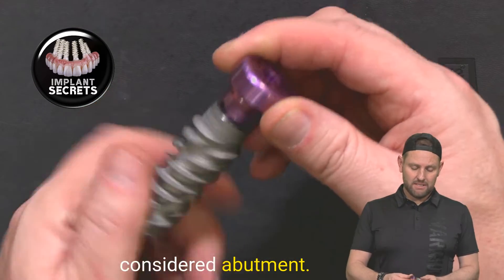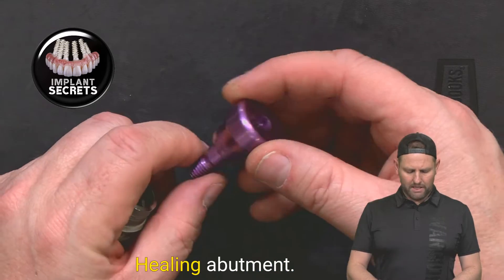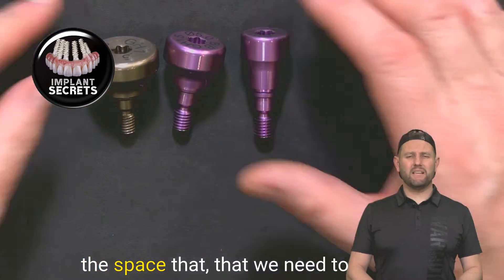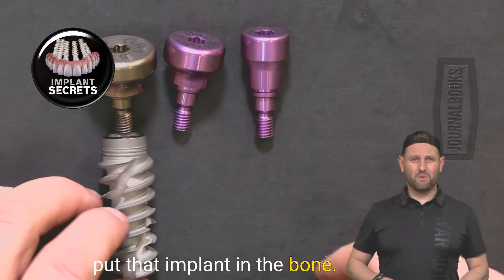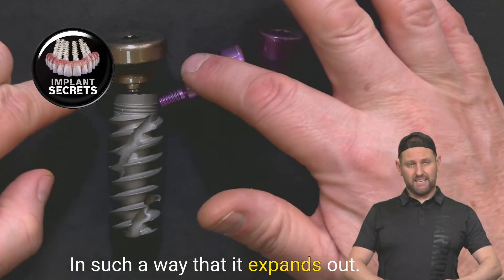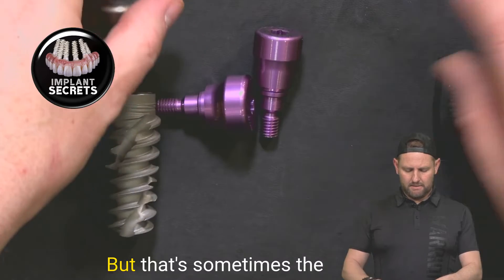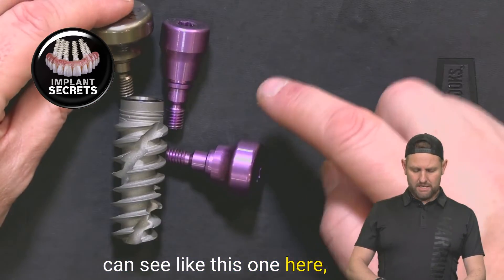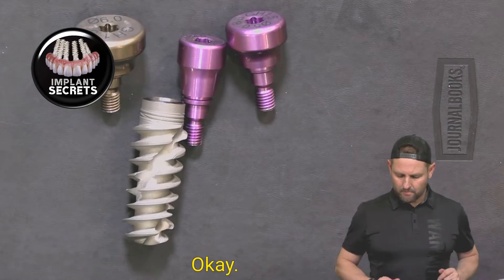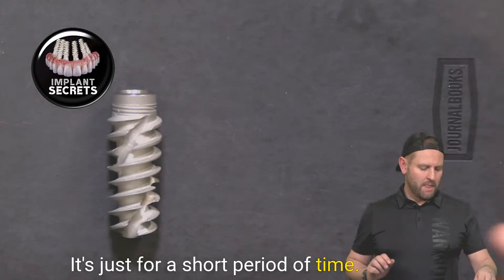This is still considered an abutment, but it's not an abutment that we build a crown on top of. This is commonly called a tissue former or a healing abutment. It can come in different sizes — you can see all these different sizes here — depending on the space we need. If there's a big wide gap, this allows us to build the crown in such a way that it expands out. Sometimes the tissue is really thick, and so we need a longer tissue former. They're just used for a short period of time.